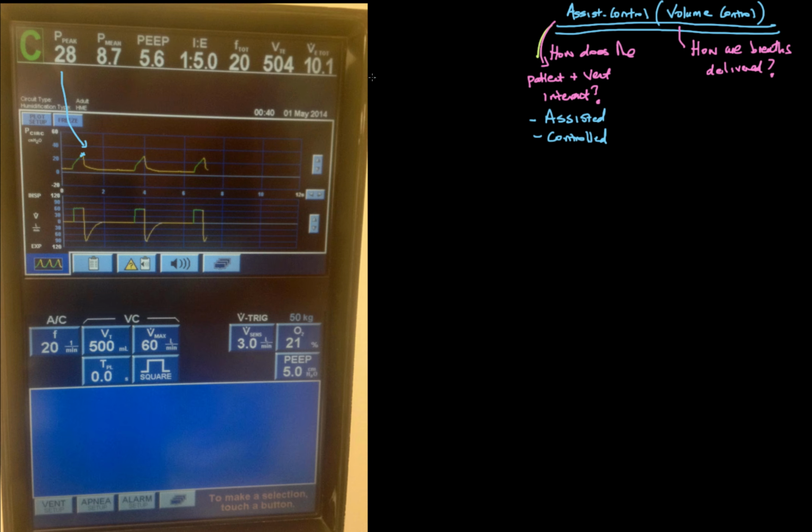When the ventilator measures volume, it measures it on the expiratory end. So there's 2 limbs of a ventilator circuit. I'll just draw this. So there's limb 1, then it comes to a Y piece. Okay, so there's our first limb, and then there's a second limb of a ventilator circuit, coming in and out of the ventilator. So this is in, this is the patient, and then it comes out.